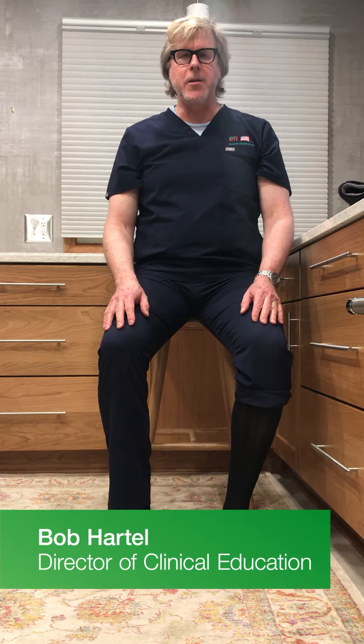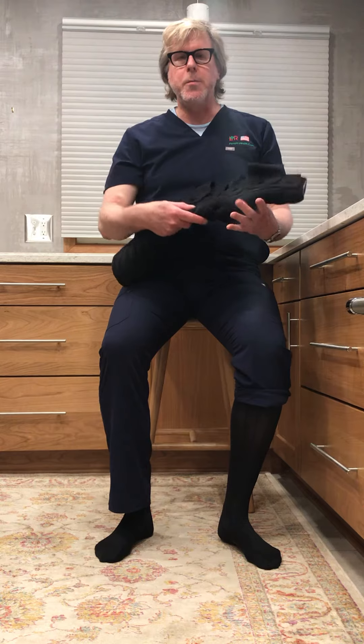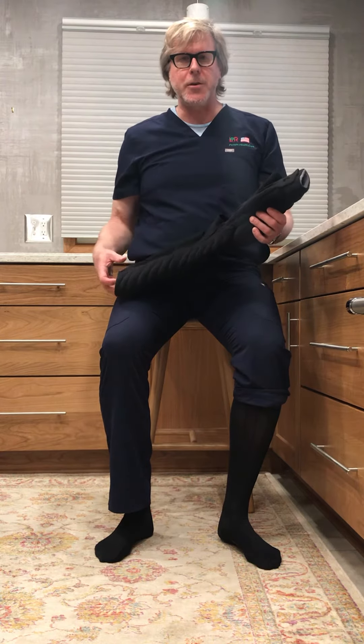Hello, I'm Bob Hartel, the Director of Clinical Education at L&R USA. In this video, I'm going to demonstrate how to don the Below-Knee Tribute Wrap Garment from the Solaris Collection.